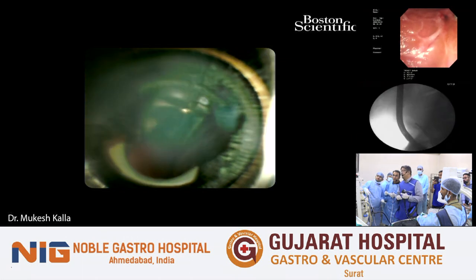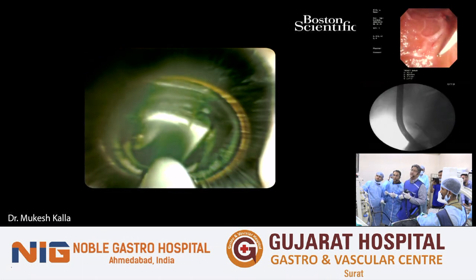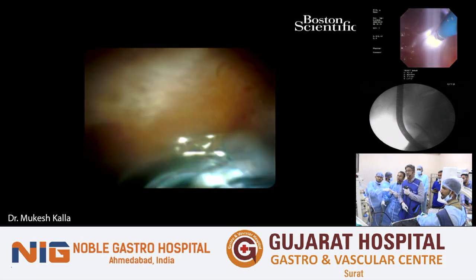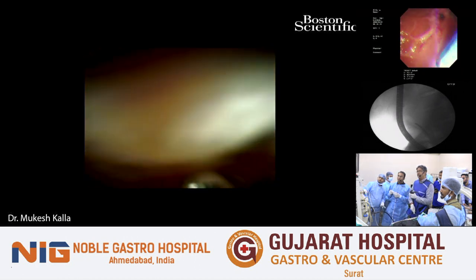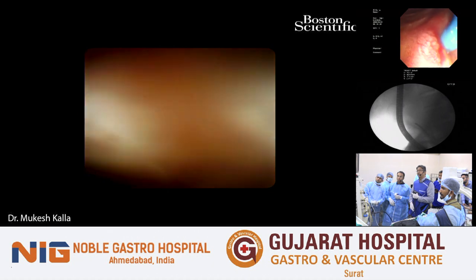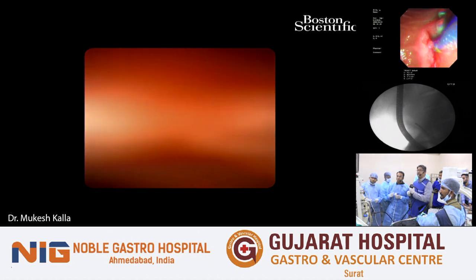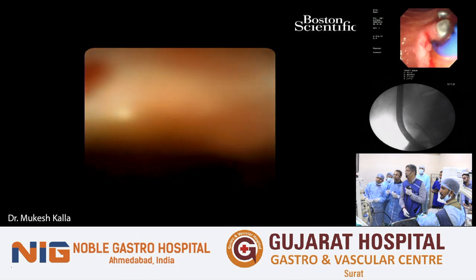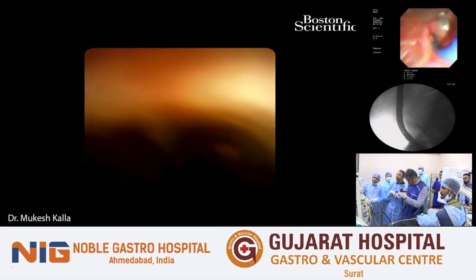So this is a challenge. Yes, now the basket is out. I think just take it. So I'll go back in again. So normally what I do, I go to the hilum, straighten my scope, and then I ask my assistant or my colleague to take the accessory out. See, these were the stones earlier which were removed. Now we'll have to look for the cystic duct again.